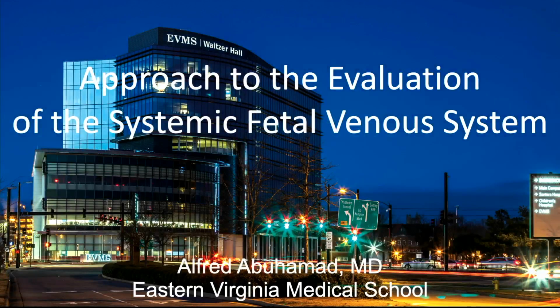My talk is on approach to the systemic venous system. This is a complicated topic, so I'm going to try to simplify as much as possible and give you really the highlights and what to look for in your evaluation.